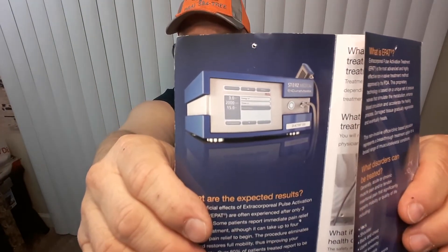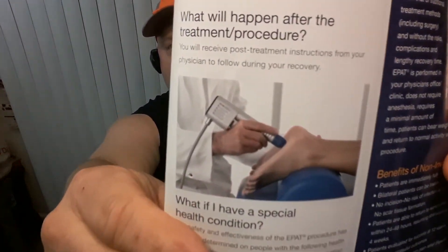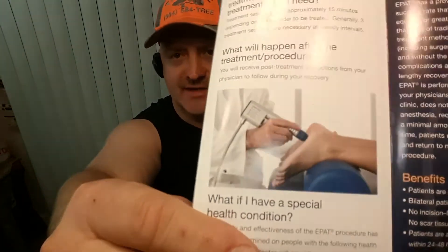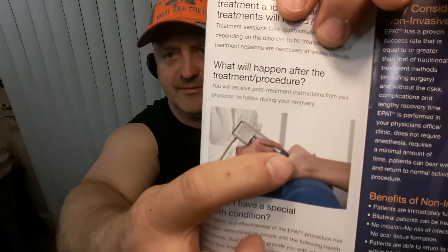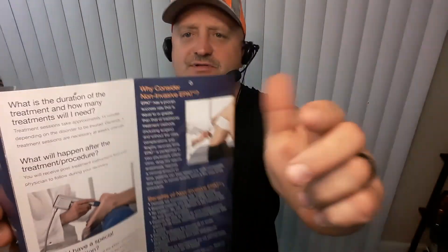They basically take a tool — I'll show you — this is what the instrument kind of looks like, what they plug it into. And this is the actual applicator that they hold in their hand — that's the little applicator that touches your skin. There's another picture of it right here.